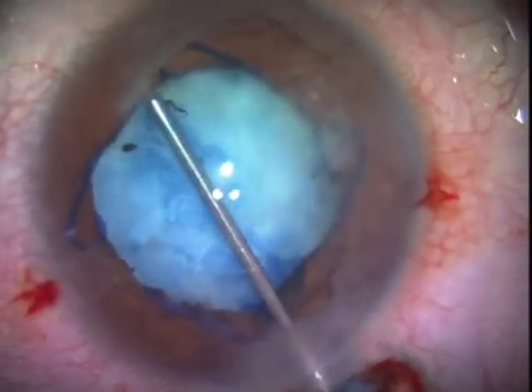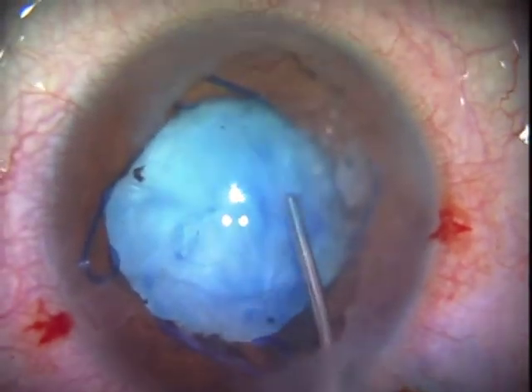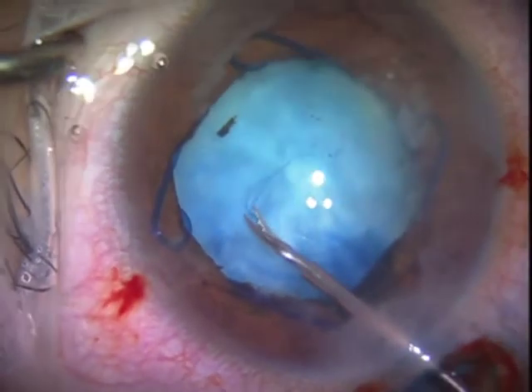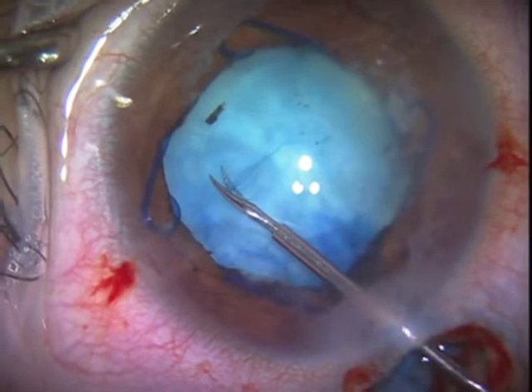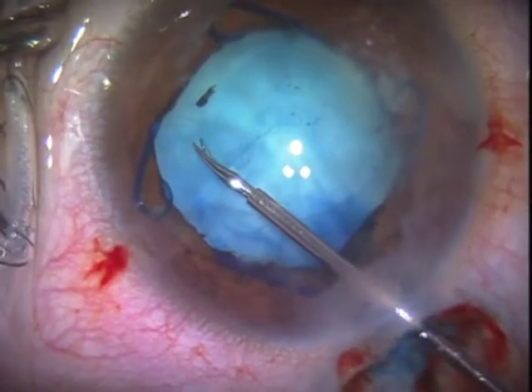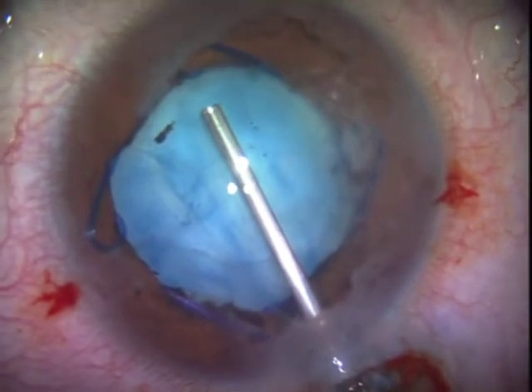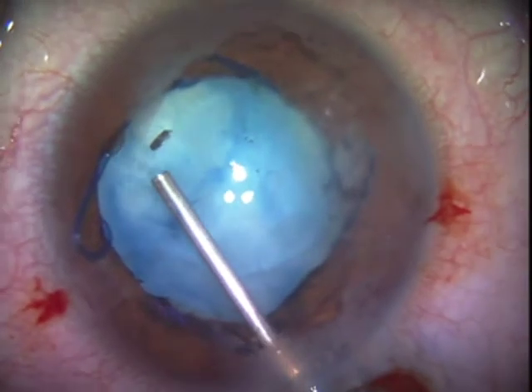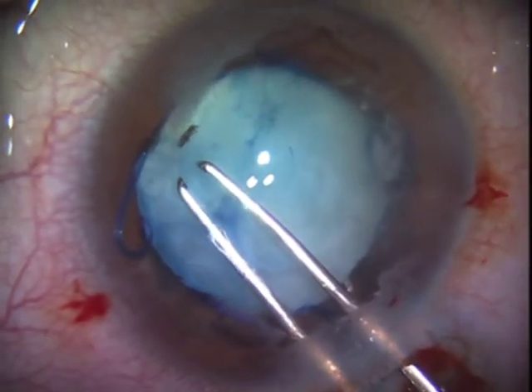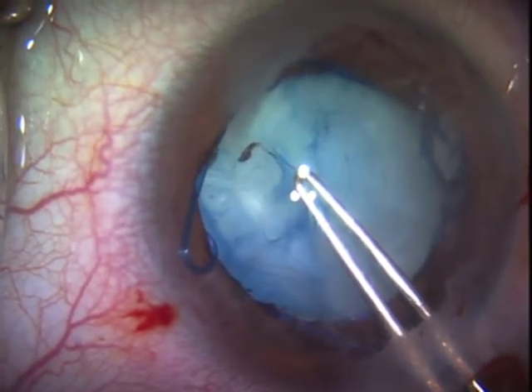A Malugan ring has been placed to expand the pupil — that part was not included here, just focusing on the challenge of opening this capsule. This lens is not intumescent and not able to just aspirate and then have a clear reflex to use for finishing the capsulorrhexis with the bag supported by viscoelastic, which I have done sometimes.